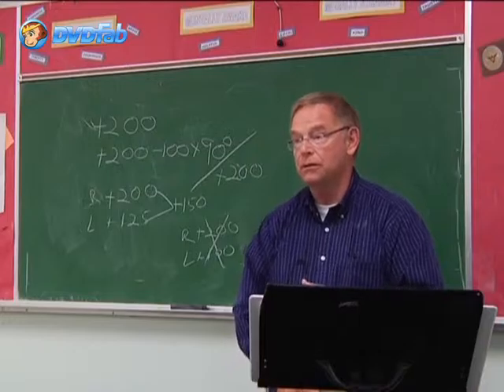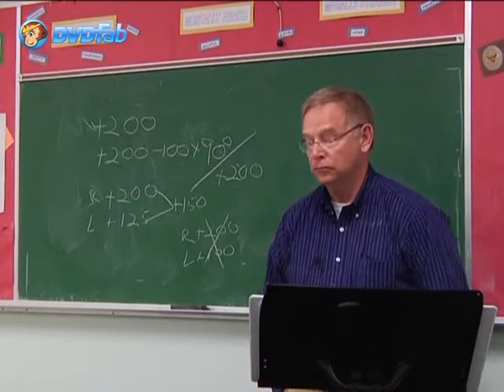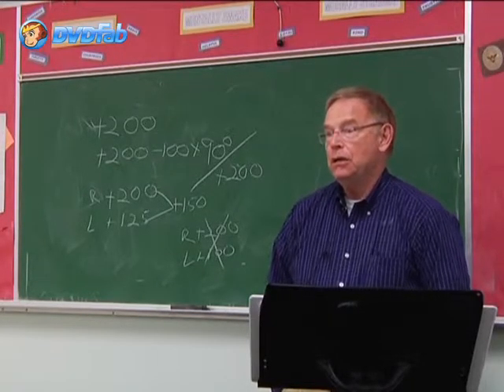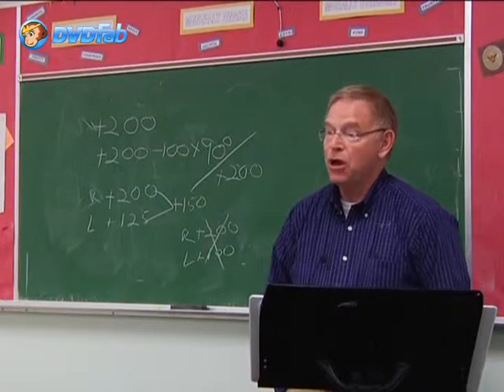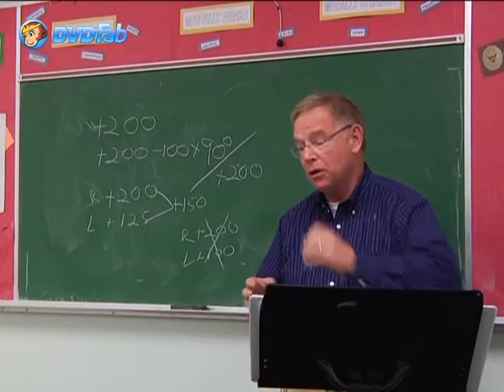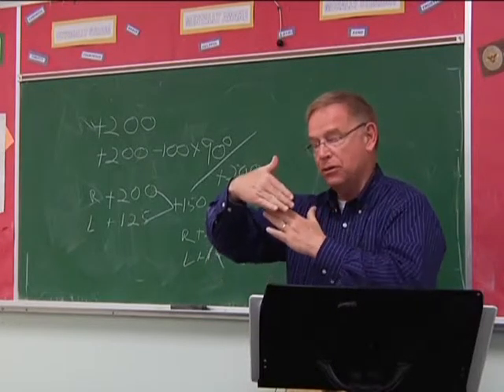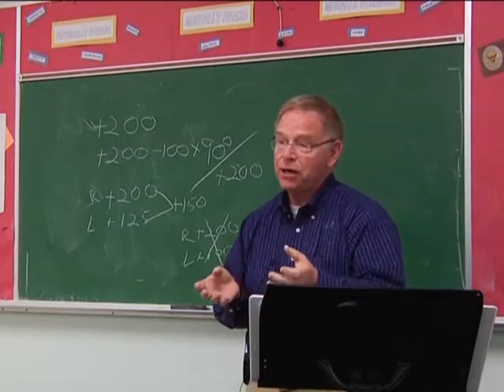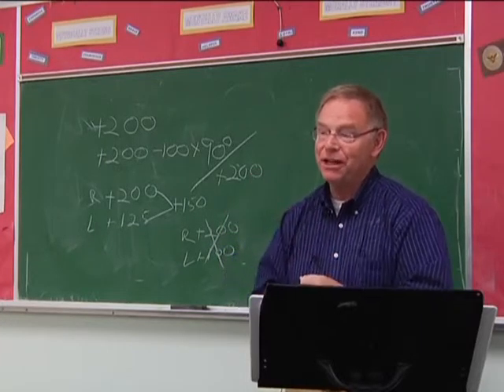Yes, sir. If you're given a bag of glasses from some other source, how, by using the wiggle test or something, can you determine astigmatism? It's difficult. You really need an instrument called a lensometer to do that. There's a manual lensometer in which you have to look in and turn a bunch of dials and line up a bunch of lines. And I don't do well with that. After I check about a dozen pair, my eyes go blurry. I start having trouble focusing everything in.